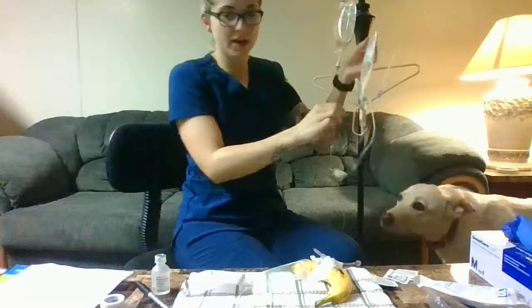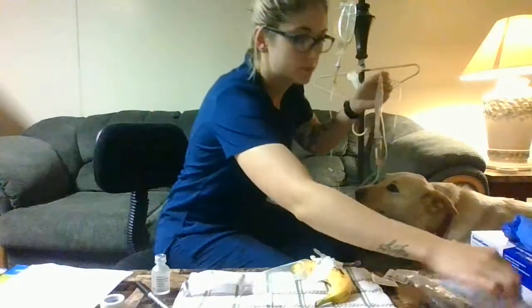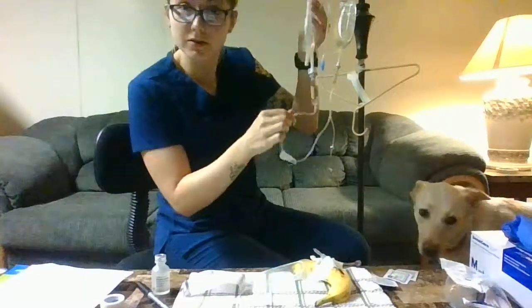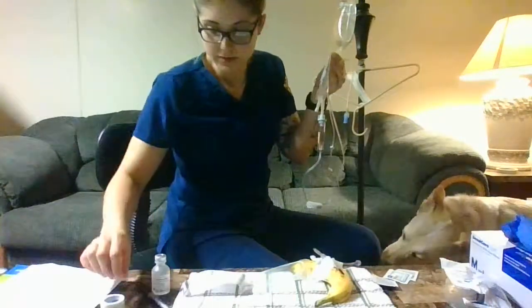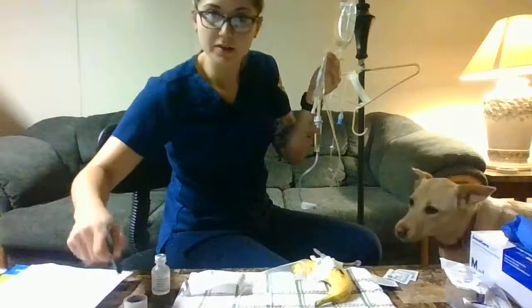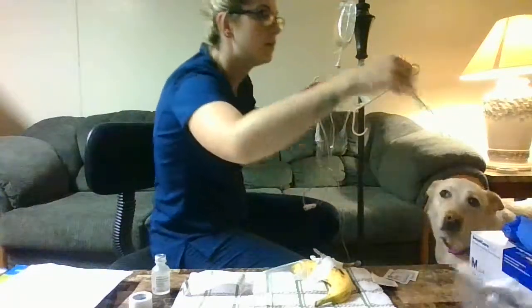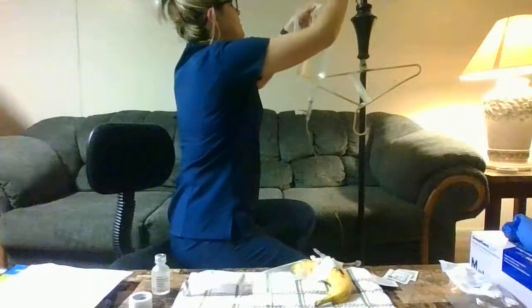So you have that ready now. And then you're also going to label this tubing as well, because tubing is good for 24 hours. So, get your tape and label the time and date that you did this. Okay. And then you have this here. Gonna go on the top.